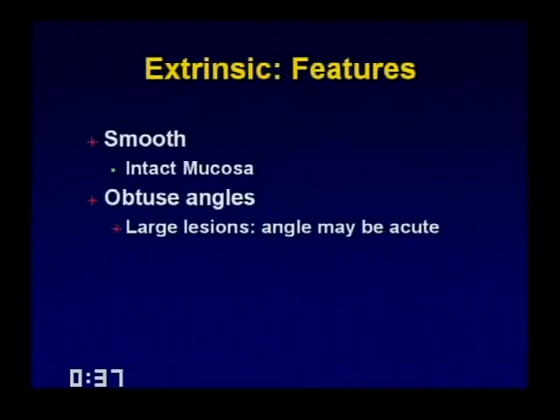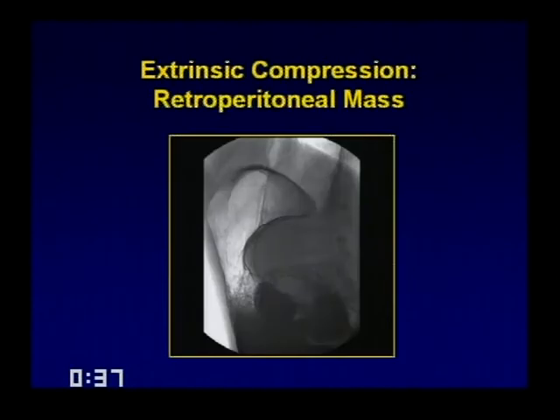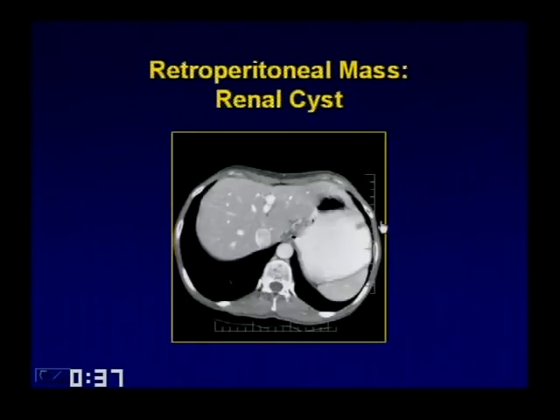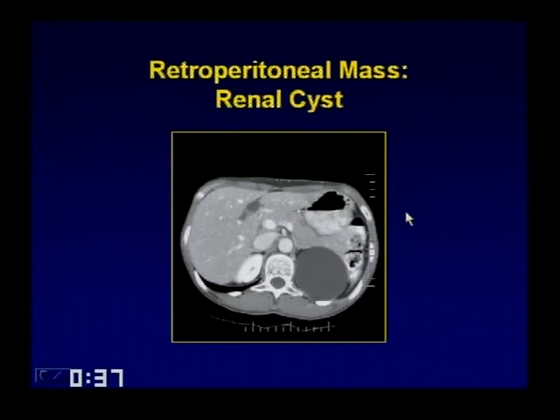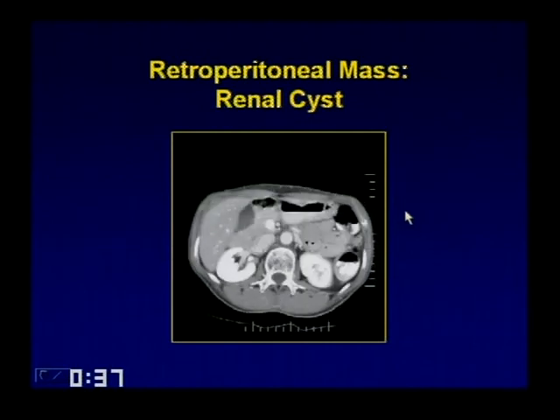For extrinsic lesions: smooth, intact mucosa, classically obtuse angles — though large lesions may show acute angles. Here's a lateral view from a double-contrast upper GI with a large mass along the posterior wall of the stomach — very hard to determine if it's submucosal or retroperitoneal. The CT scan reveals it's simply a cyst in the upper pole of the left kidney pushing on the stomach. Sometimes cross-sectional imaging is necessary. Going back to the esophagus, a smooth defect along the left wall just above the level of the arch turned out to be an aberrant right subclavian artery running posterior to the esophagus and causing an indentation on the posterior-lateral wall.